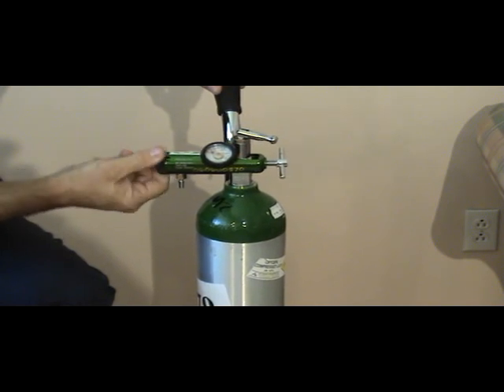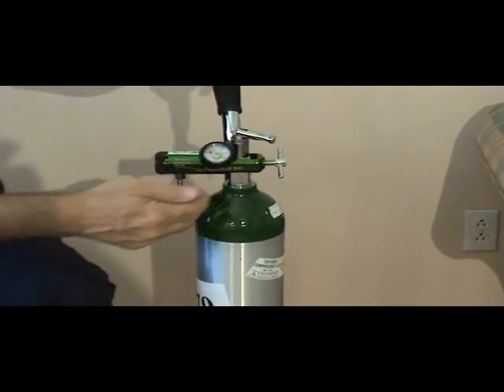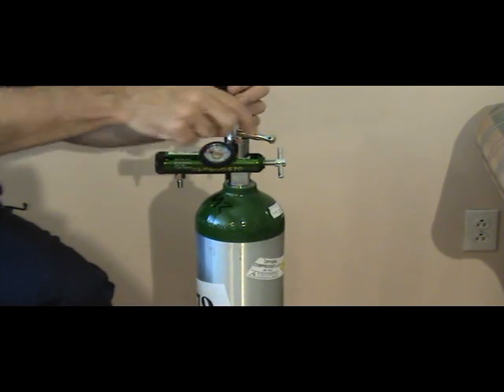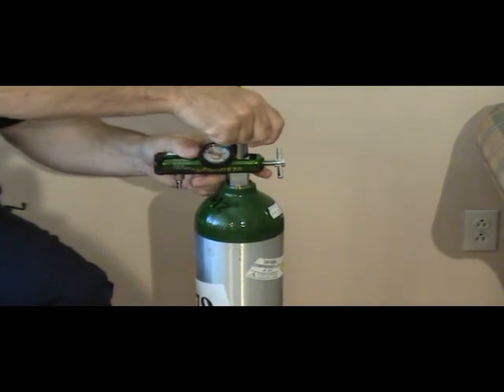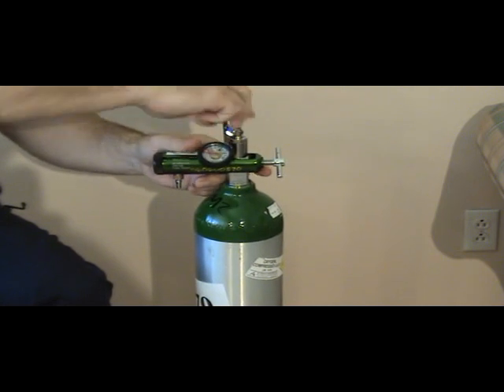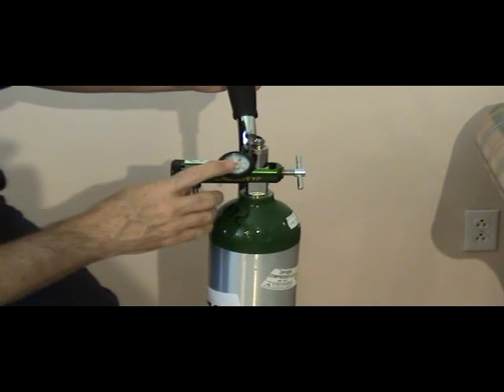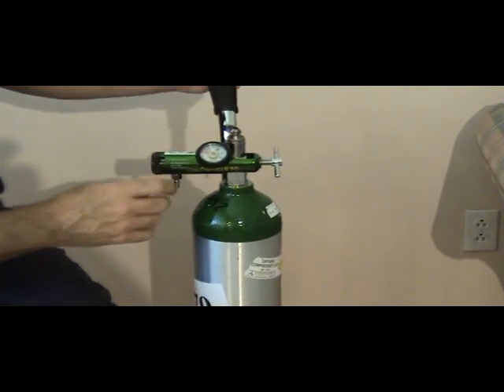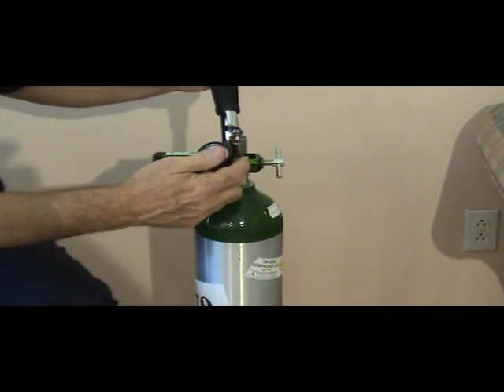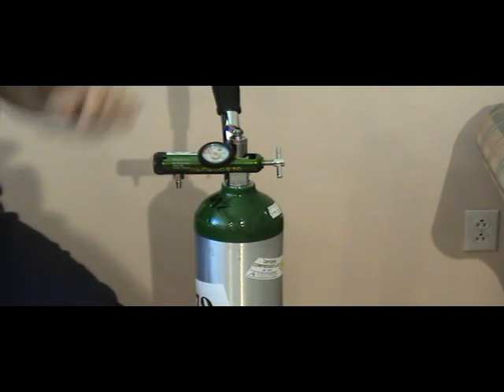So we're going to set that first at 0 to make sure that there's no leakage around this area. Set at 0, so we're going to turn this now counterclockwise. You don't have to turn it very far. That's far enough. Now as I've done that, and I'm looking here, I see that the arrow is now at 2,000, which indicates a full tank. I don't hear any leakage around here, so we're fine as far as it's now on the bottle perfectly.